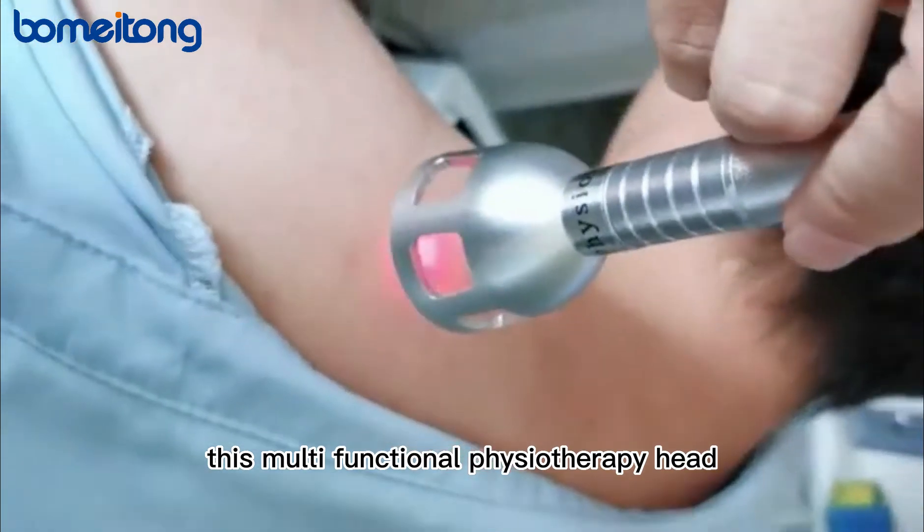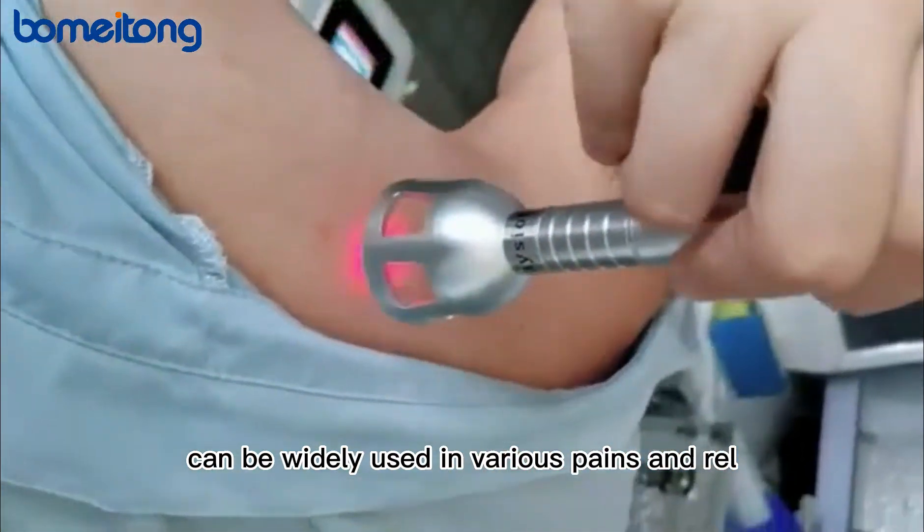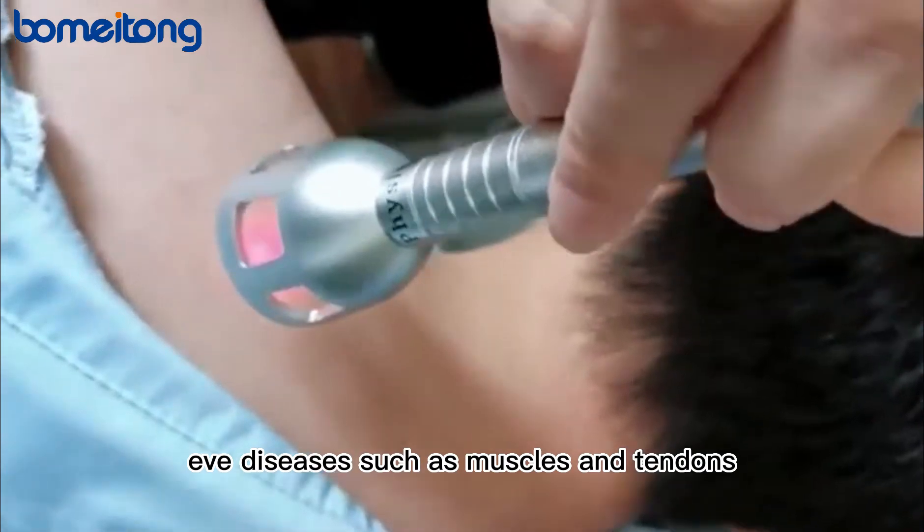This multifunctional physiotherapy head can be widely used in various pains and relief of diseases such as muscles and tendons.